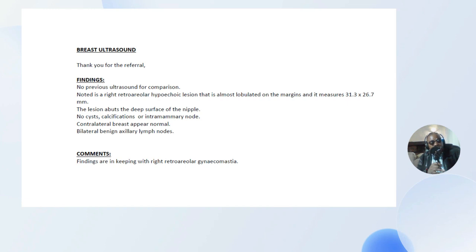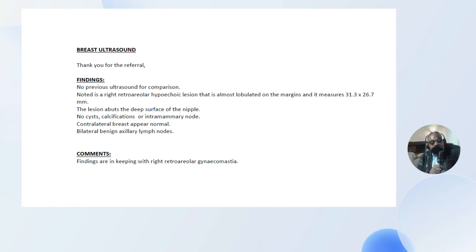No previous ultrasound was available for comparison. When doing most examinations it's critical to track history — check when the mass was noted, its dimensions, whether it's growing, and any architectural deformations. In this case there was no prior history to relate to. Noted is a right retroareolar hypoechoic lesion, almost lobulated on the margins, measuring 13 by 26.7 millimeters. I should note I was lazy and only took two measurements — a mass should be captured in three dimensions. Don't be lazy; capture all relevant information.